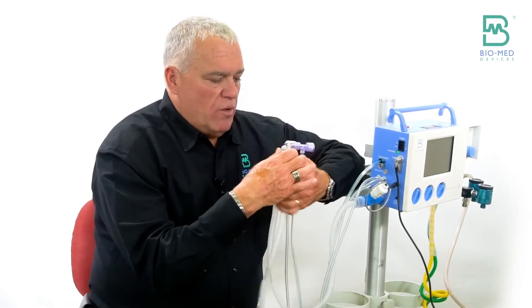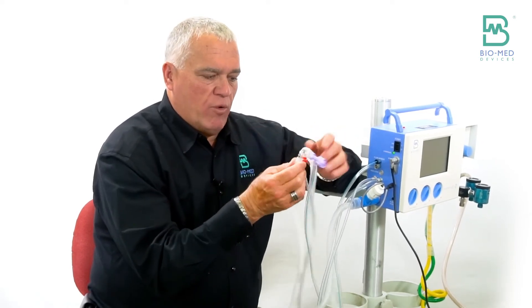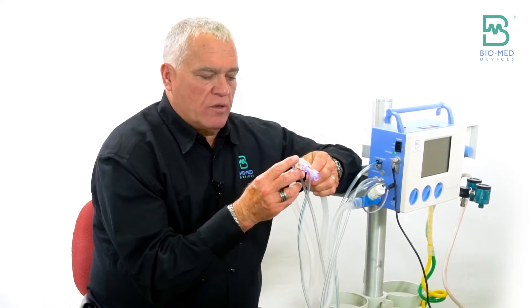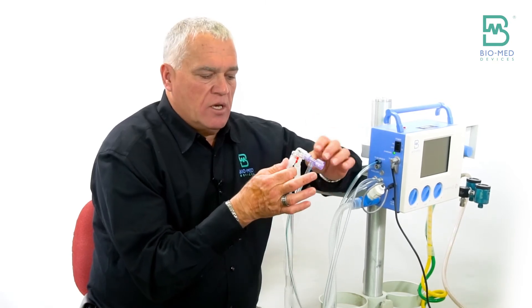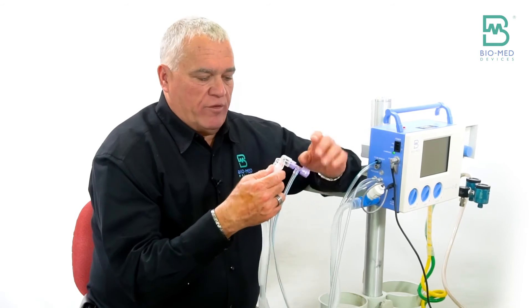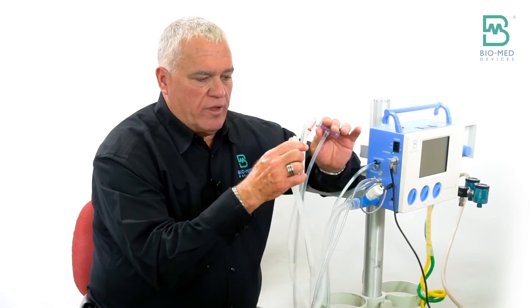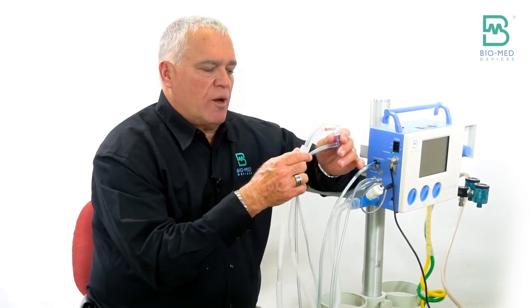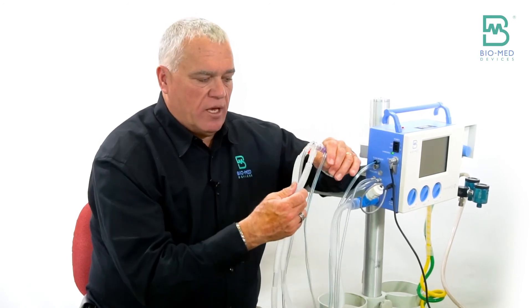We also have circuits where the Y is removable. In a lot of cases, you have to remove the Y to use a specific nasal prong CPAP interface. So in both circuits — both the built-in circuit and the standalone — we designate this removable circuit with an N. If you don't need to remove the Y, you can order our standard circuit, and these are heat sealed to the Y so you pretty much can't get them off.